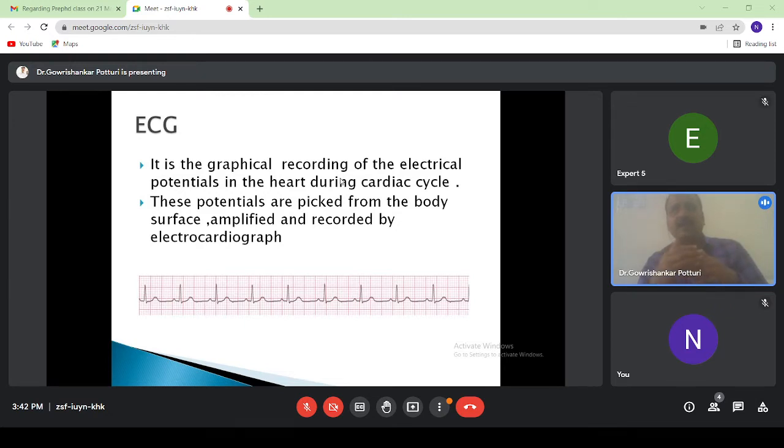As a result, the black paper behind looks like a scribbling. So you get a black line. Actually, it is a gray color coated paper. If you see an ECG paper, it's a wax paper. Black color paper covered with gray color wax.